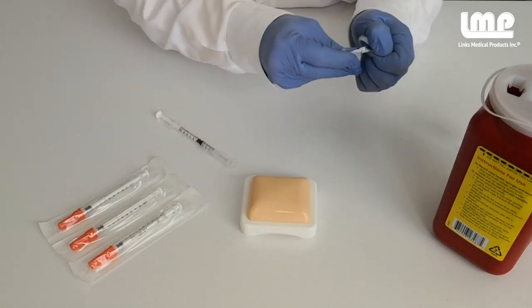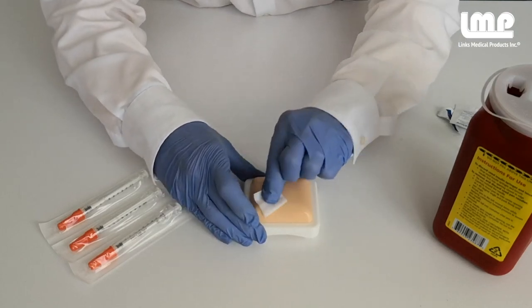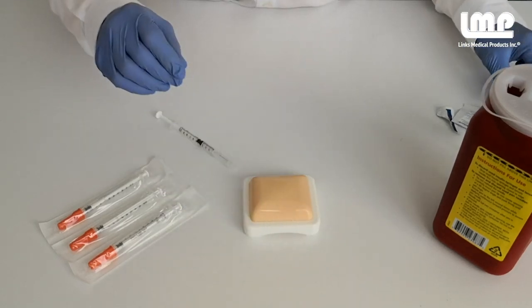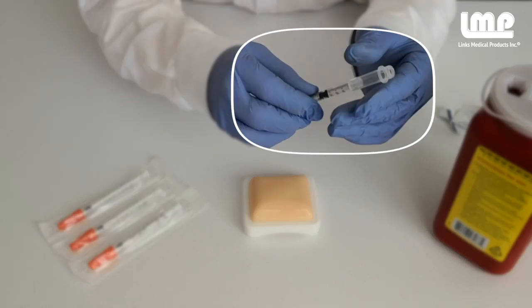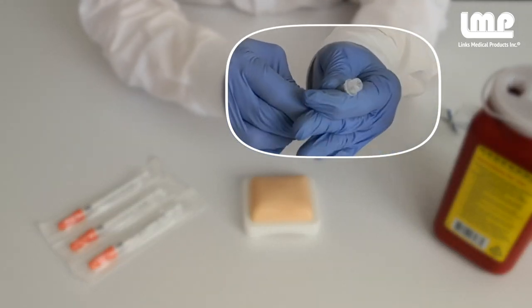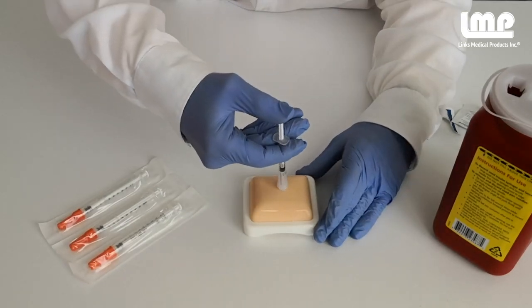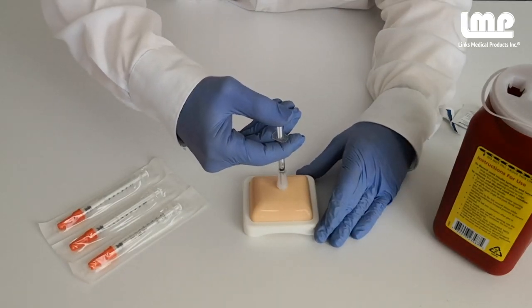When it's time to give the injection, cleanse the injection site. Slide the safety shield back until you hear the click, which indicates it's in the original position. Follow your institution's guidelines for injecting the medication.